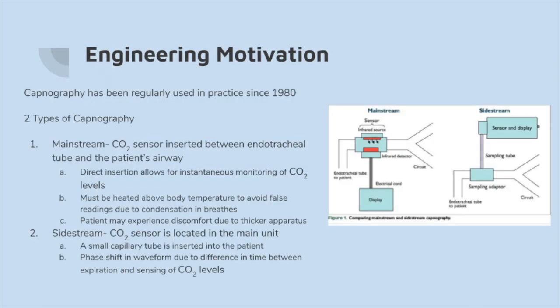Over the years, capnography has developed into a rapid and accurate way to measure PCO2 levels in a variety of different settings and procedures. Capnography was first used in World War II to measure the levels of CO2 soldiers were being exposed to. It was used for the first time in a medical setting in 1950 to monitor CO2 levels of patients when placed under anesthesia. However, with the advent of smaller devices, it was not until the 1980s that capnography was regularly used in practice.